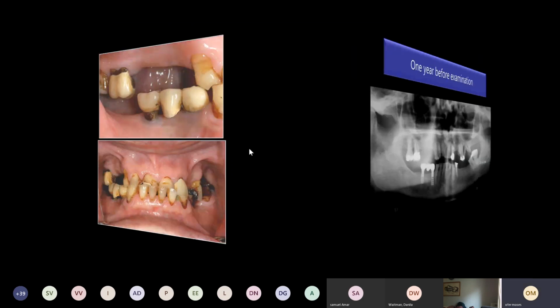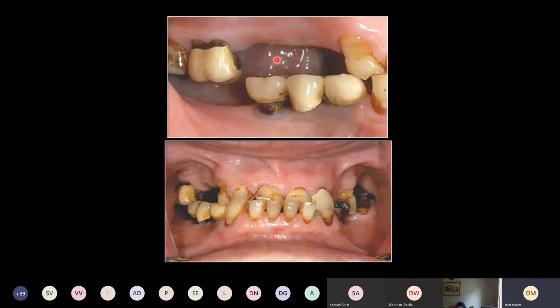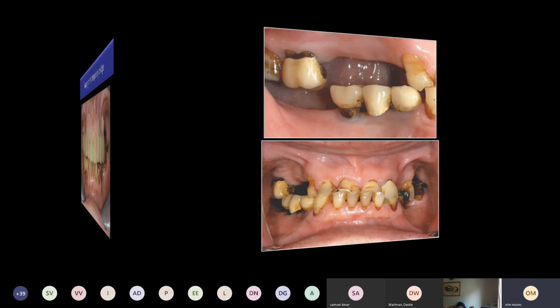Again, this is a close-up without the denture. You see there are some prosthetic problems. Since this is not my profession, I will not go into details. The photographs will speak for themselves, I hope. And this is from frontal view. You see the location of the lower crowns in comparison to the center of the ridge of the upper area in front of it.